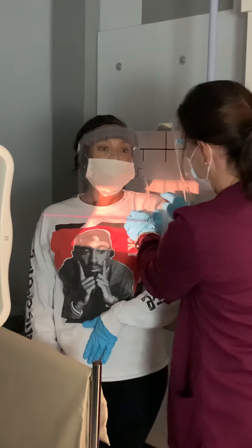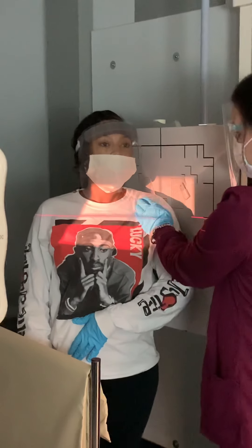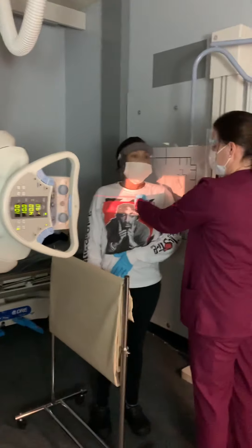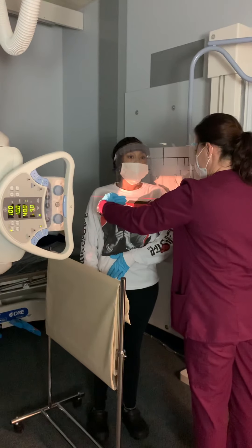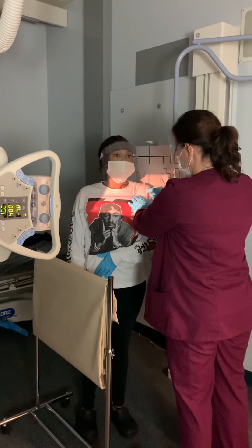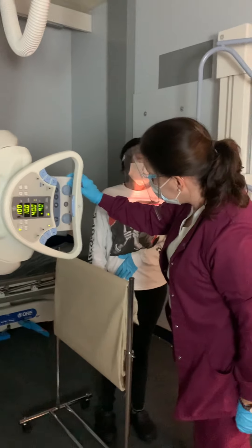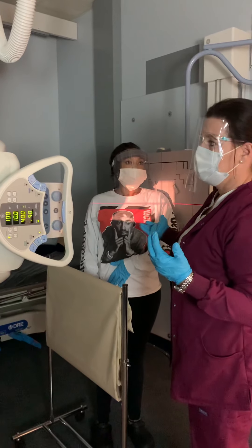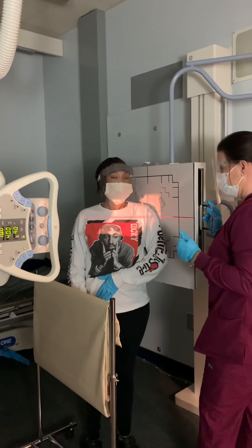Basically you're coming in to the shoulder joint. See how her humeral head rounds right there? You're coming right into that shoulder joint. This central ray may be a little off depending on the patient's chest size and soft tissue. But remember, the patient's body is angled and you're still coming straight through that joint space. The joint has to be over the center chamber. I'm going to collimate down to eight by ten. You can really go eight by ten crosswise or lengthwise — it doesn't really matter. Some places go in even closer. Just go with whatever your hospital or facility's protocol is.